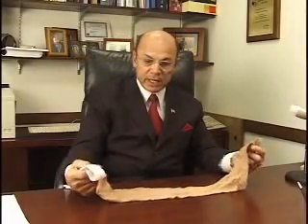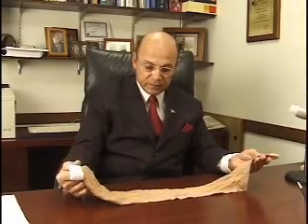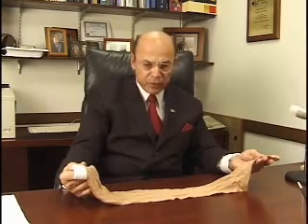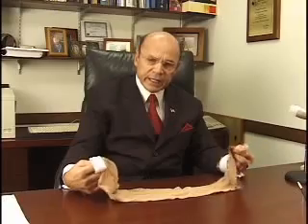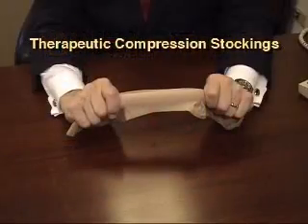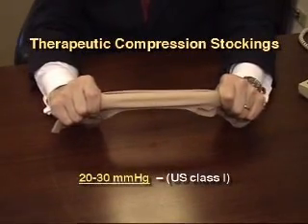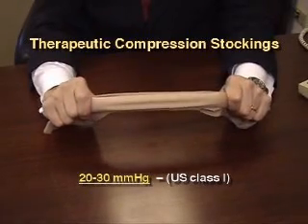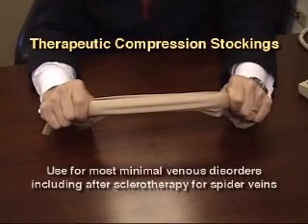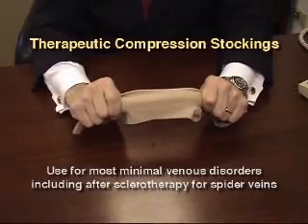Here we see a typical anti-embolism stocking in beige. They also come in white. These stockings, although not really useful for patients with venous disease, are widely used for people with swelling and after operations on the legs. The next stronger stocking is a Class 1 product which must produce between 20 and 30 millimeters of pressure at the ankle, and this is graduated downward toward the thigh. Not all brands produce the same pressure at the ankle, but they must all be within that range.